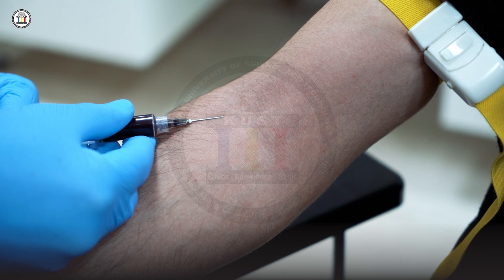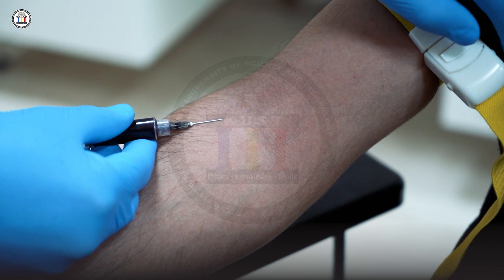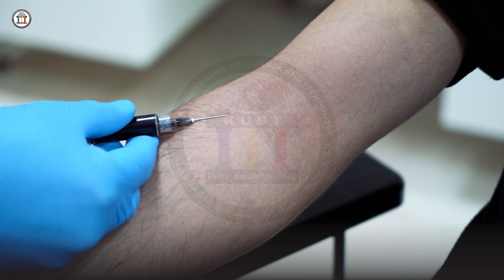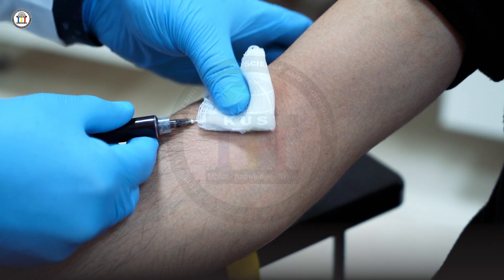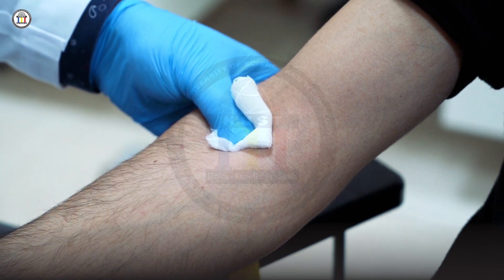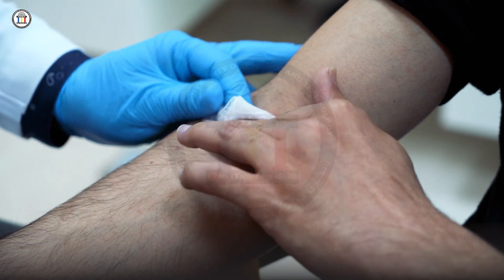After finishing the blood drawing, if you have collected a sufficient amount of blood, remove the tourniquet gently. Do not remove the needle yet — apply the gauze, then slowly remove the needle. Tell the patient to apply pressure for about three minutes.